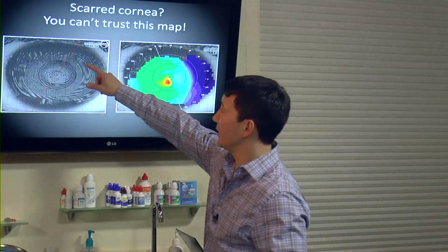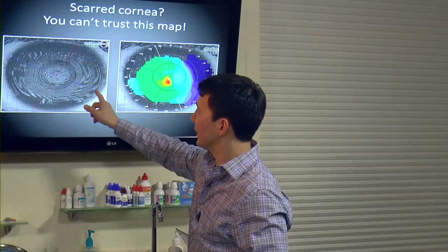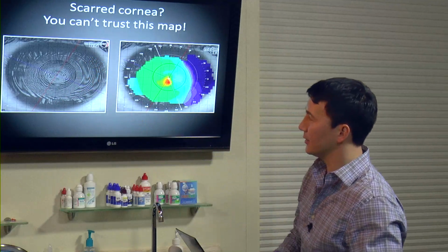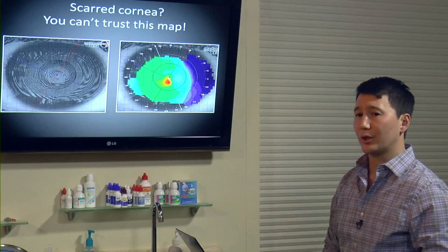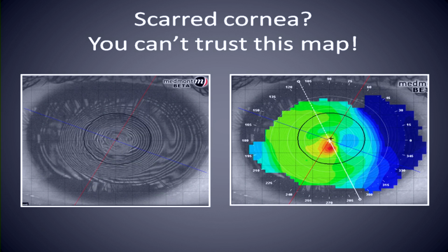The only thing I can say is, here's where my lens bears, right here, and it seems like it has a bit of lateral movement. It's bearing in here, bearing in here. You can see that in the flattening out of the placido reflection. But otherwise, this topography, we don't know if we can trust at all. So put on a real thin soft lens. We usually use a plus lens because we'd rather think the cornea is higher in depth, so we build a lens slightly on the steeper side rather than slightly on the flatter side and maybe get touch.